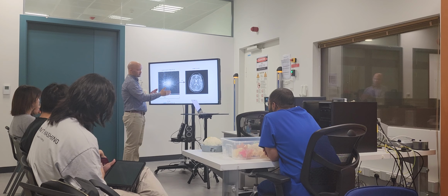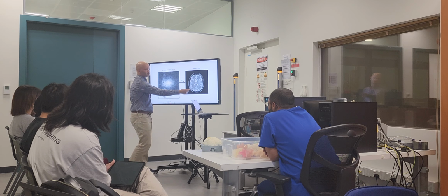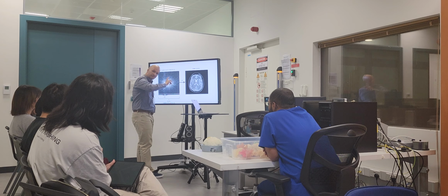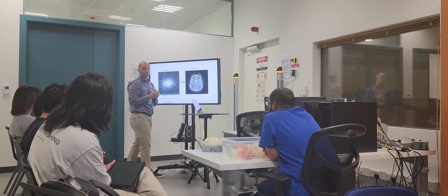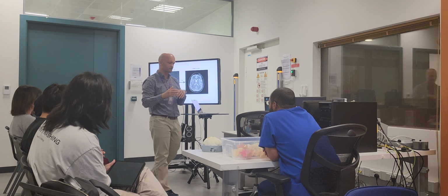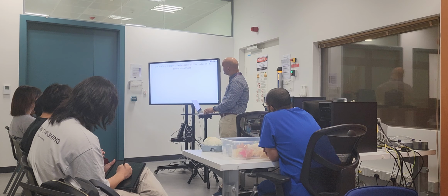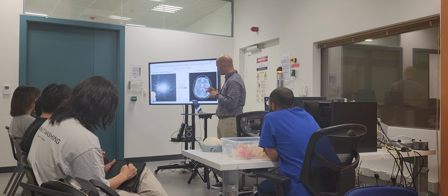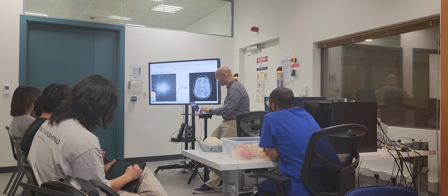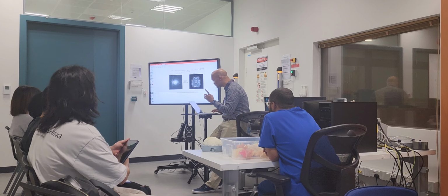The big part here, how far I go in k-space, 1 over that is my pixel size. Vice versa, how fine I sample, delta kx, 1 over that is my field of view. Reciprocality of Fourier space, Fourier transform, yeah? And that's essentially, I'm just gonna skip a lot of the, okay, so this is clearly the size I have for this space.